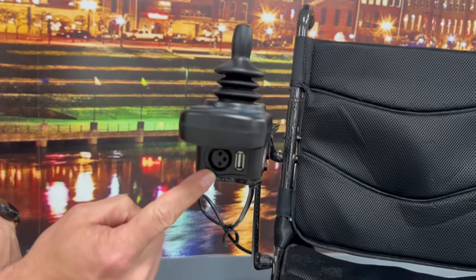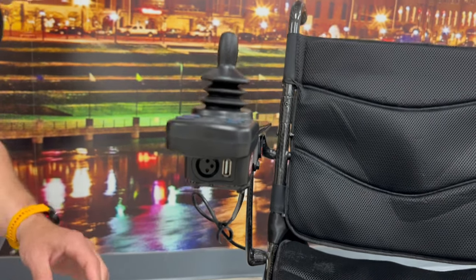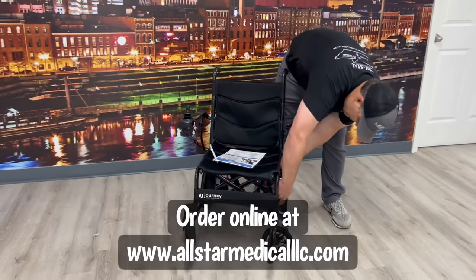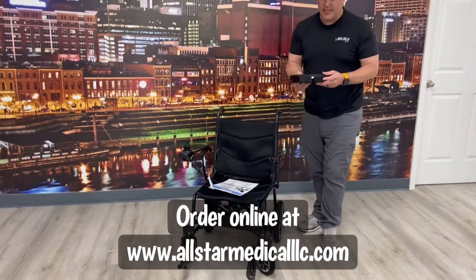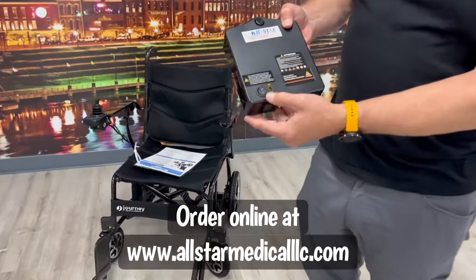On the actual remote, this is where you charge it, and it also has a USB port so you can charge your phone off it as well. There's a place for an additional battery if you need more range. The battery is very simple — it just pops on and off. When you start the unit there's an on/off button right there.